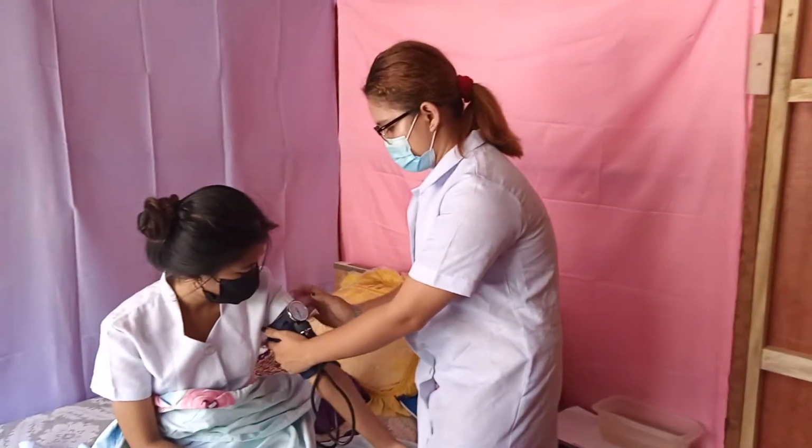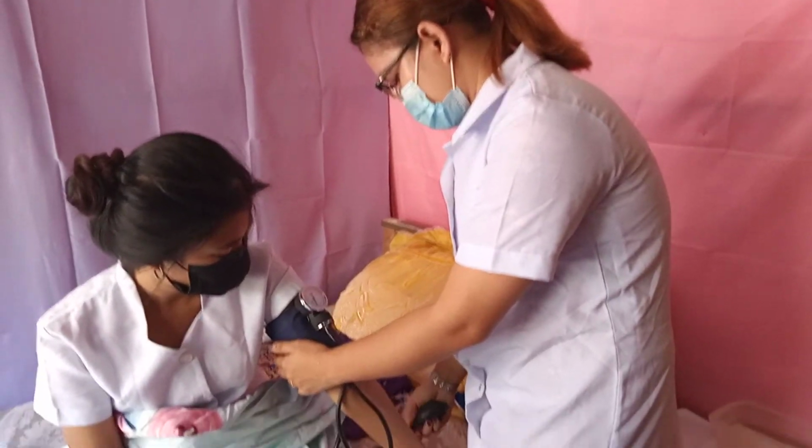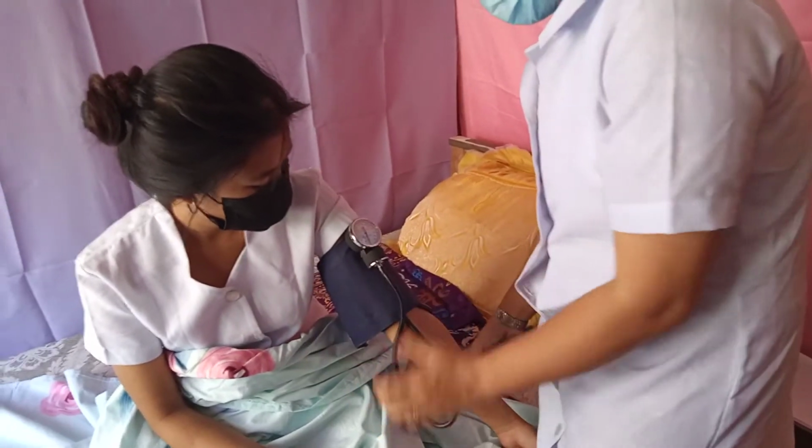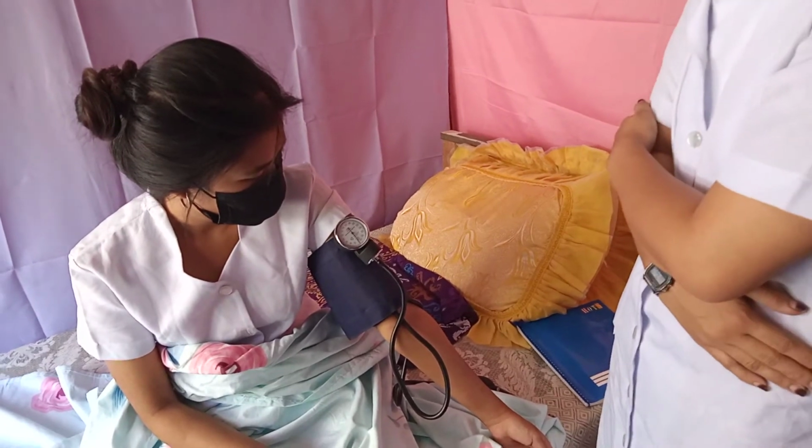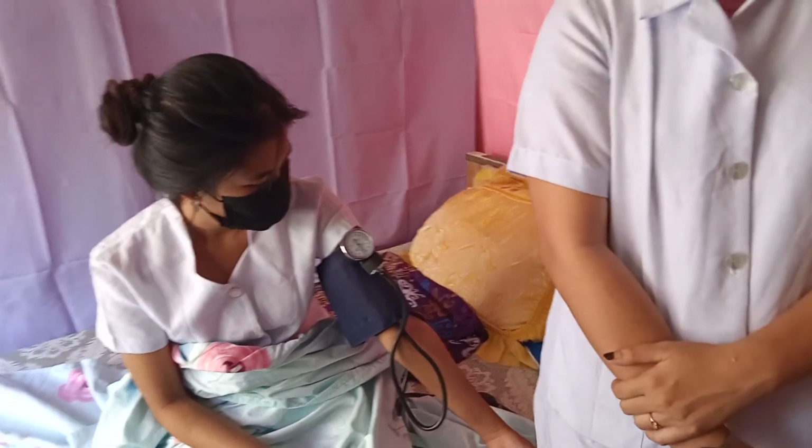After that, wait for 1 to 2 minutes before making further assessment. Rationale: to prevent false reading. Next, place the stethoscope earpiece in your ears and close the screw valve on the air pump. Rationale: sounds are heard more clearly when the earpiece follows the direction of the ear canal.